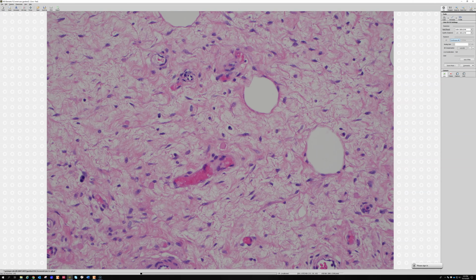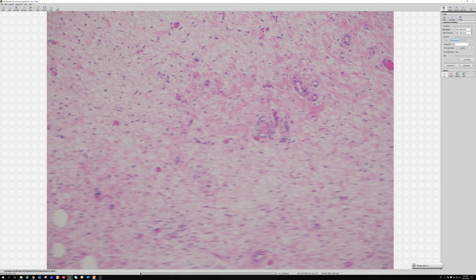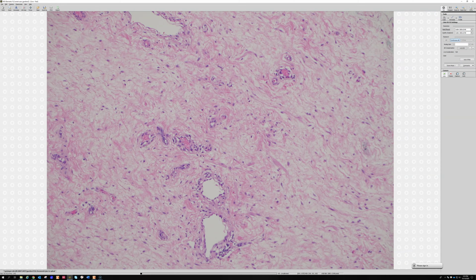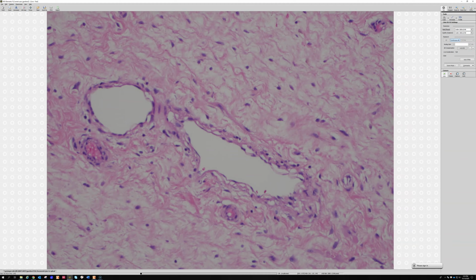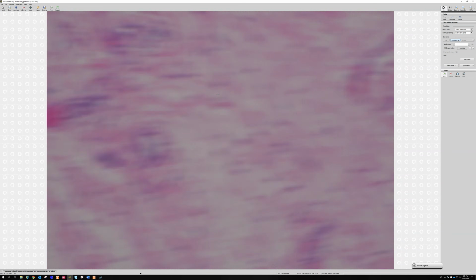And a lot of times you'll see those little muscle cells branching off around the outside of a blood vessel and stretching out into the middle space in between the vessels. It's a very subtle clue, but it so far has worked out pretty well for me ever since Mark taught that clue to me. I thought that was pretty nice. You can see one here. See this guy? It's coming right off the wall of the vessel and stretching out away into the soft tissue. Definitely a very subtle finding.